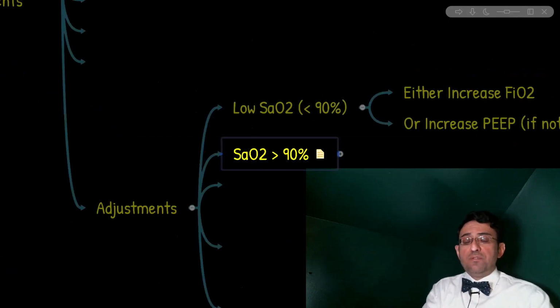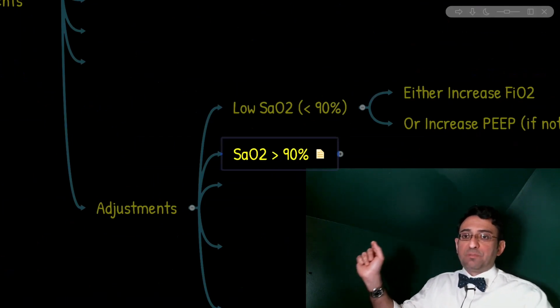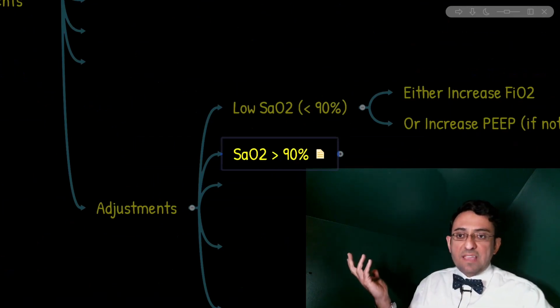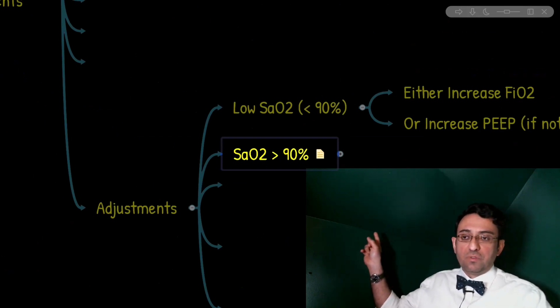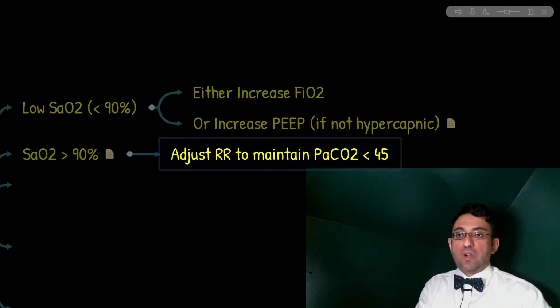What are the other reasons we want to avoid high PEEP in hypercapnic failure? Always remember, increased positive end expiratory pressure also causes collapsed pulmonary capillaries. Collapsed pulmonary capillaries means increased dead space, and that is a basis of actually hypercapnic failure, if you again return to our formula of minute ventilation. Now, next case just focuses on our understanding of hypoxic versus hypercapnic failure.